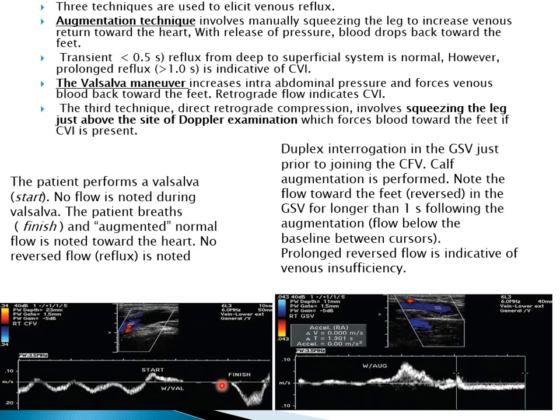For all of the techniques, the valve should be competent. With a competent valve, blood flows in one direction, just towards the heart. Any reversal of flow means the valve is incompetent. Reversal of less than half a second is acceptable. More than 1 second, insufficient.